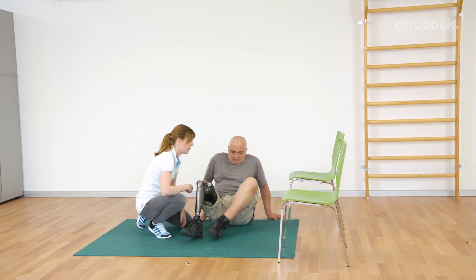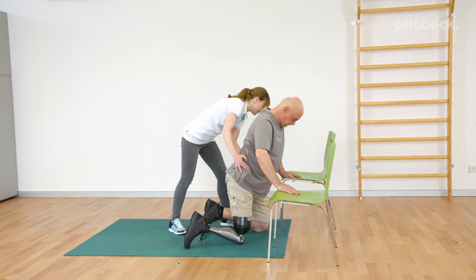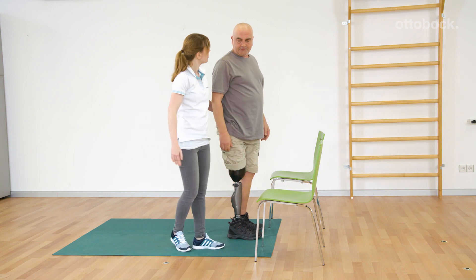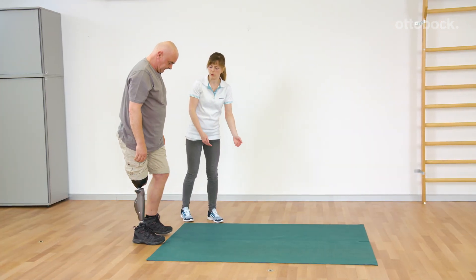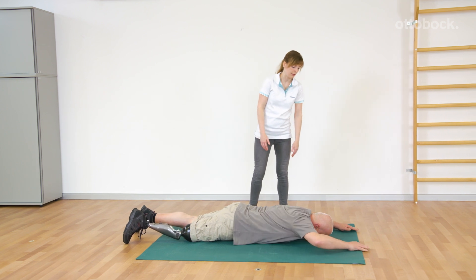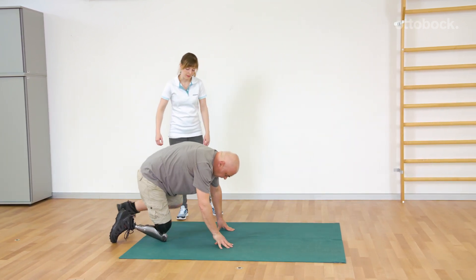Gerhard then stands up from a kneeling position. When using this method in everyday life, it is absolutely necessary to use the protector. The movement is absorbed by the arms and the contralateral leg. The preferred method varies from user to user.